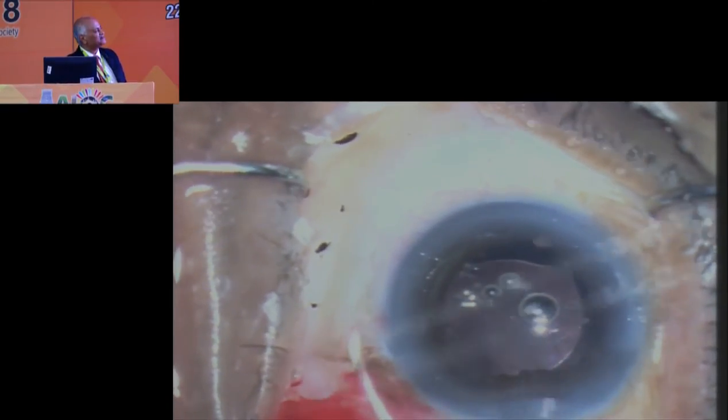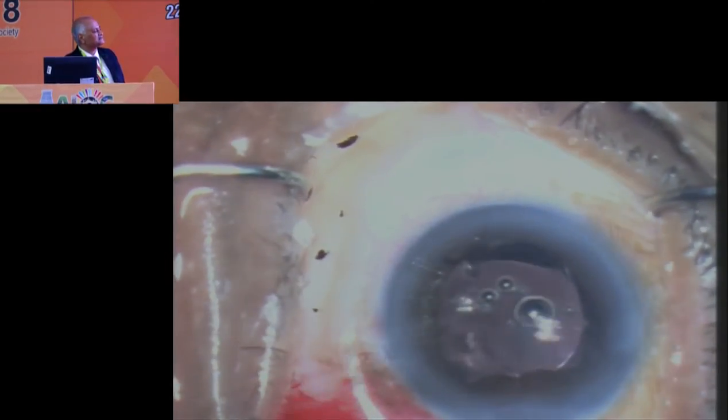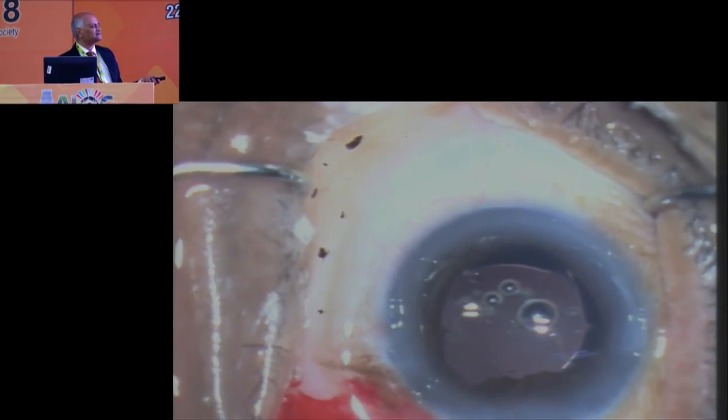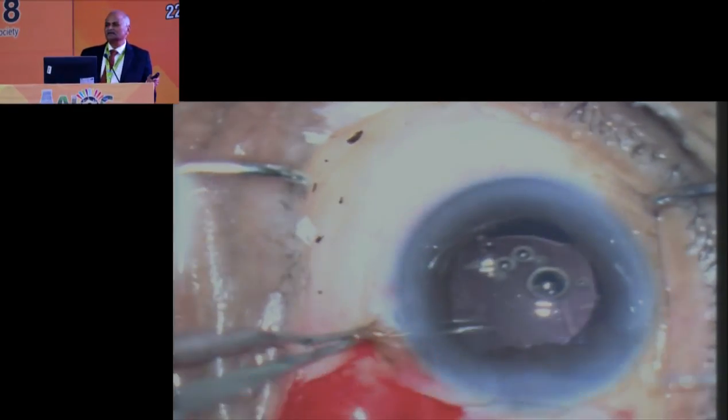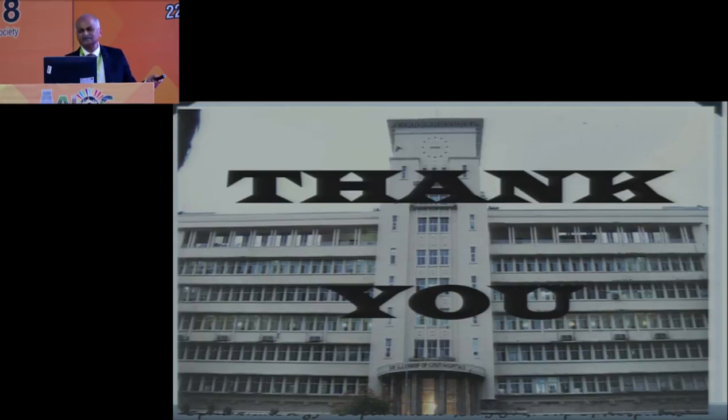And see here, I have just dialed the lens in the sulcus, and the lens is implanted in the sulcus, and I could do proper surgery. On the second day the patient is having good vision, except SKs, there was nothing. So the only thing is that whenever you are managing anything, you will have to concentrate and manage it.